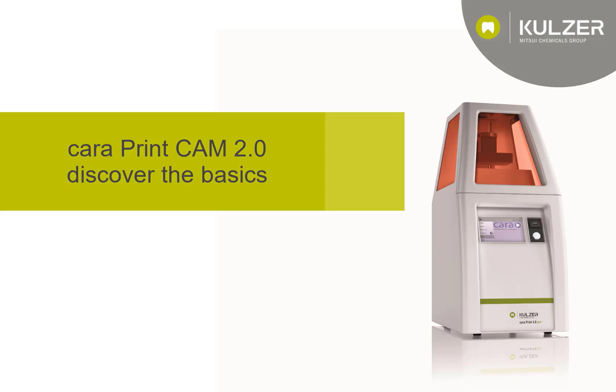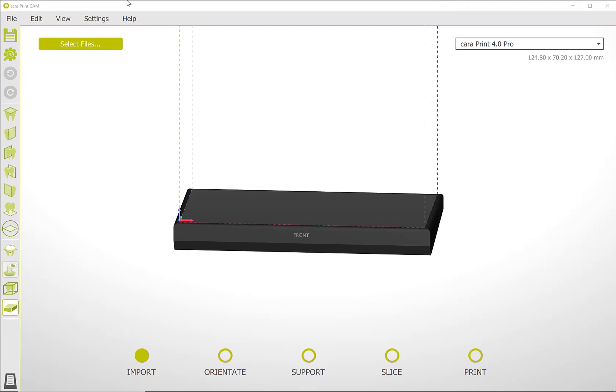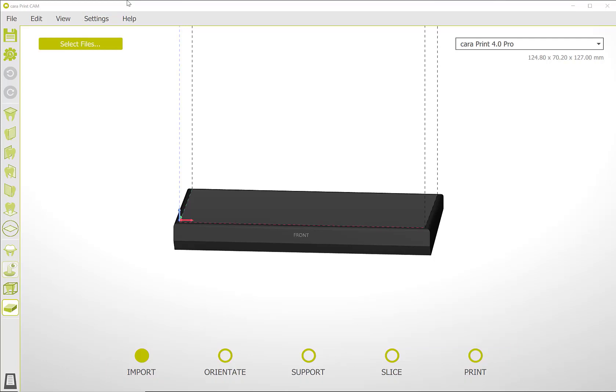This video shows the basic functions of the Cara Print Cam 2.0 software. The software guides you through the process, with many functions automated. In a second video we show you how you can also use the software individually.